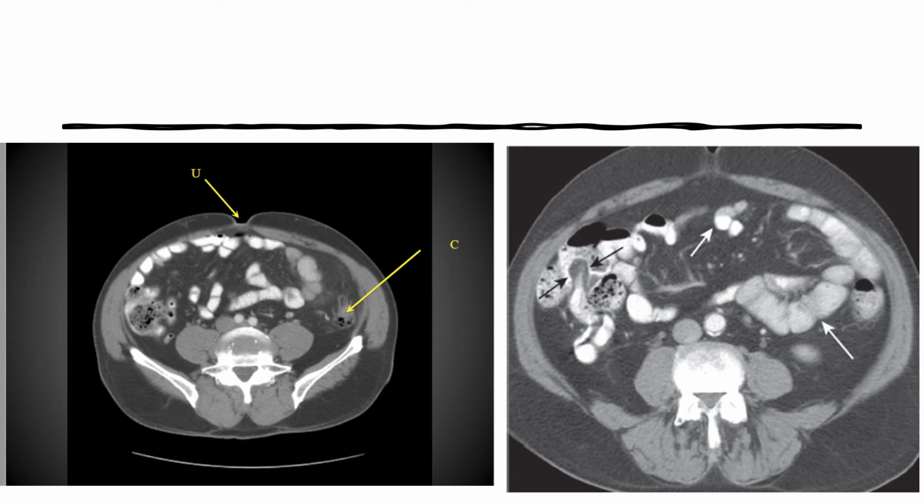These two images represent normal CT scans of the small bowel at the lower levels, almost entering the pelvic region. You can orient yourself with the coxa as a bony structure as well as the lumbar vertebrae. You can also look at the muscles surrounding the area. In this lower region, you can use the obliques. And in the right image, you can use the gluteus maximus, where they would be depending on how low you are.